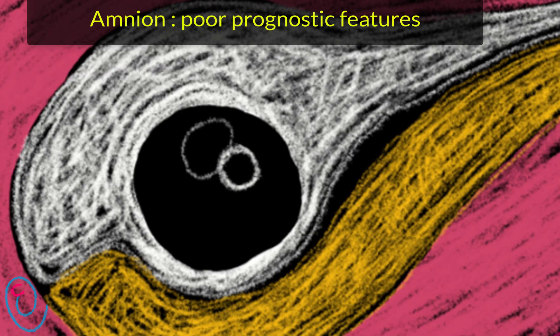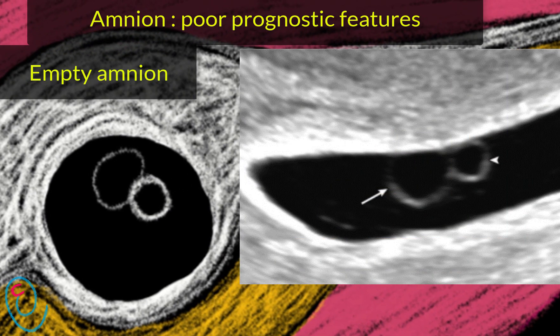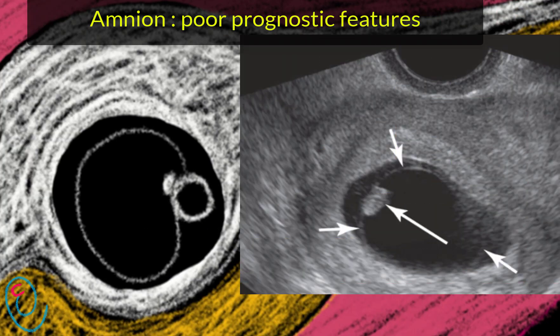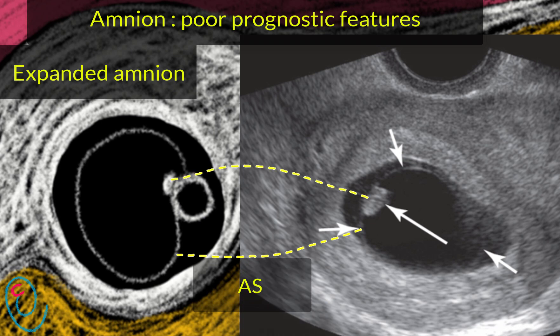Empty amniotic cavity without an embryo is a feature of concern. Sometimes it may be difficult to differentiate between a large yolk sac and an empty amniotic cavity, but this does not make a difference because both features are poor prognostic features and require more frequent follow-up. Regarding expanded amniotic cavity, the amniotic sac diameter and the crown-rump length are usually within 1–2 mm of each other, and a larger amniotic cavity compared to the crown-rump length is also a feature of concern.